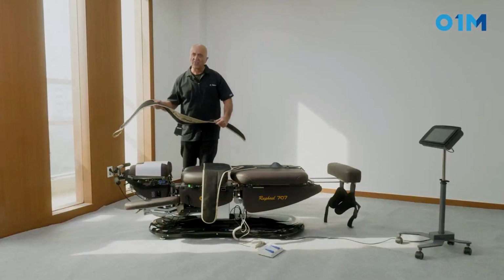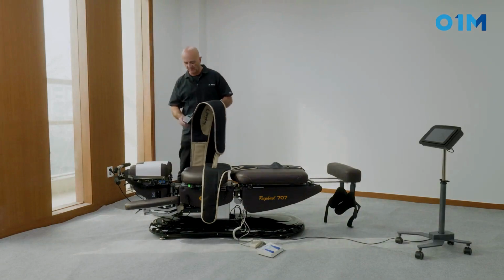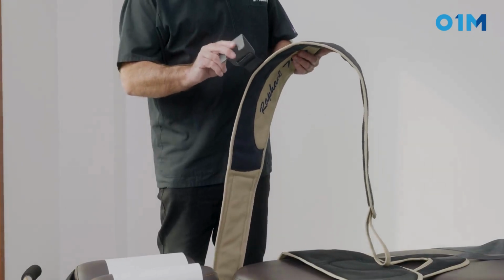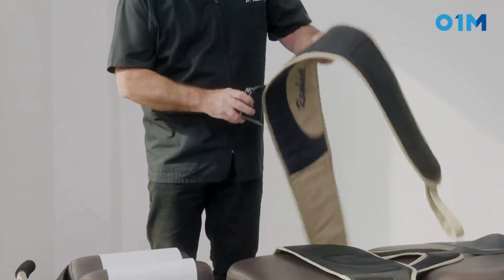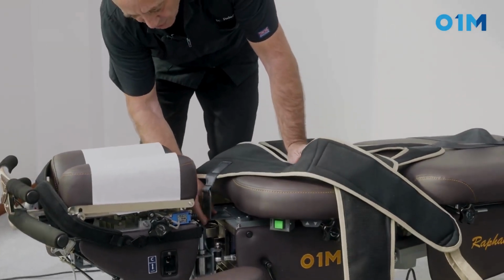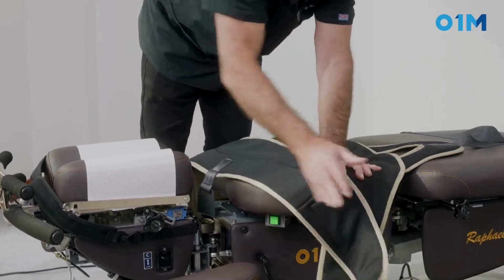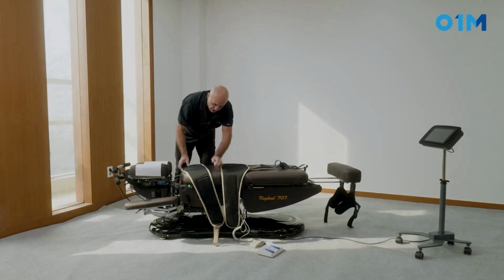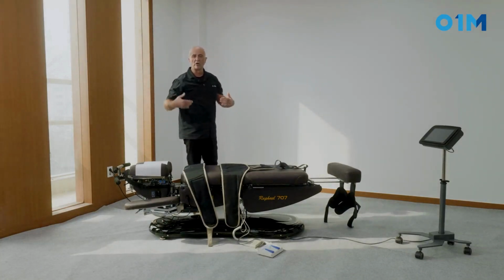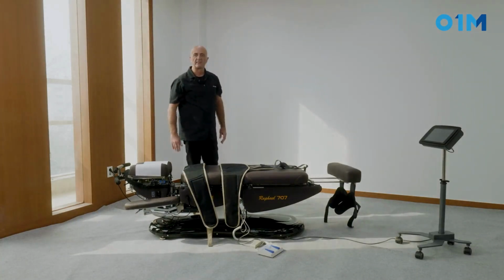So this is a thoracic section, the one that will go on the upper part of the thorax of the patient. And this too has an L-shaped bracket on it, and you will place the L-shaped bracket just under a plate that you have at the section right here. And you will lay down flat. For the patient, he will be able to lay down either prone or supine, and the traction will happen between those two segments.